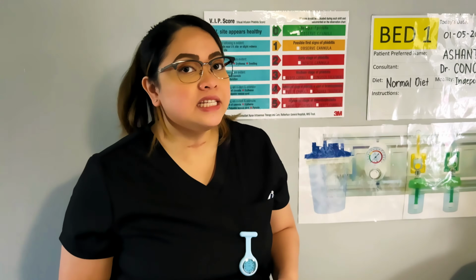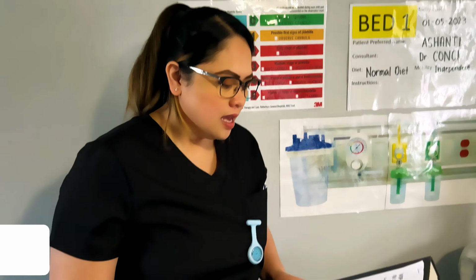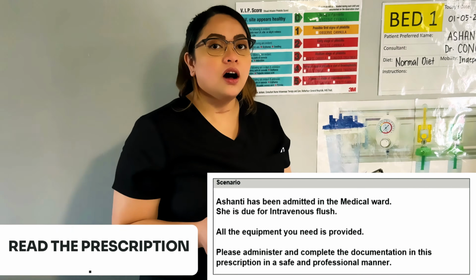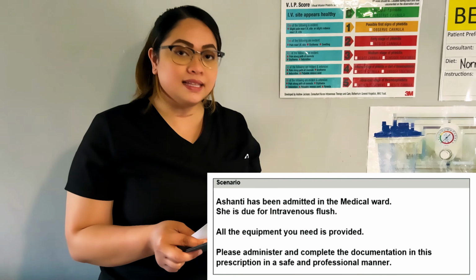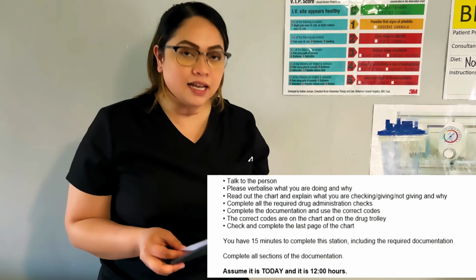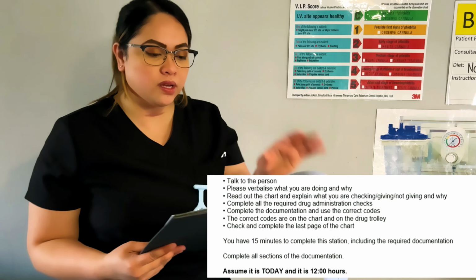After washing your hands, you have to check the prescription. So let me just check the prescription. This prescription is for Ashanti. She's been admitted in the medical ward. She is due for intravenous flush. All the equipment you need is provided. Please administer and complete the documentation in this prescription in a safe and professional manner. Assume it is today and it is 12 noon, 1200 hours. So I'm gonna read the prescription now.